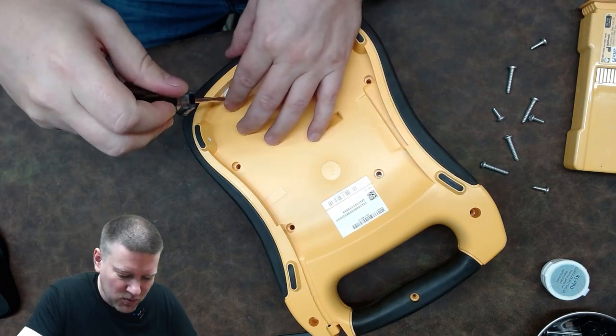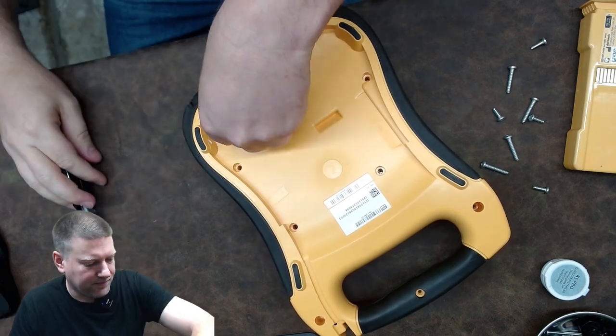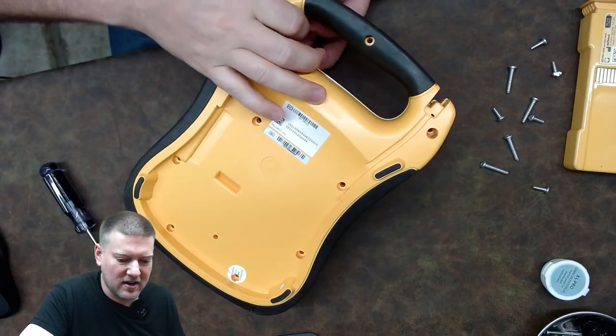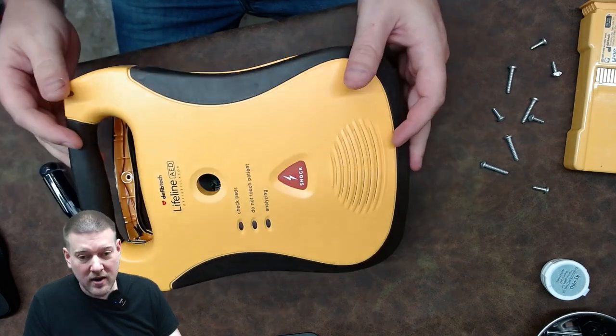I've always wanted to open one of these up. That's a crazy seal too. Alright, we got it! On the back is where all the components are connected. From the side you can see numerous cables that connect from one board to the other.